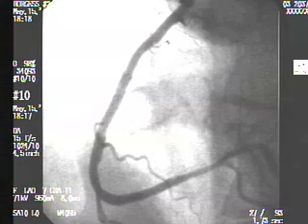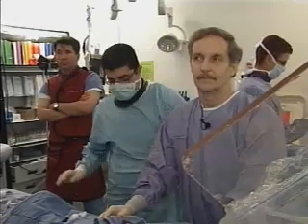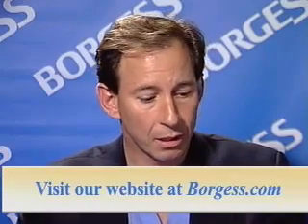We're going to cut back and just wrap up now with a couple of final comments that I have. I had a couple of quick questions that I will answer. Someone asked, is all of the embedded drug released from the stent? The answer is that the drug is completely gone within about 2 months, and the vessel typically takes 3 or 4 months to heal. The drug's gone in 2 months, and there's no residual drug left.